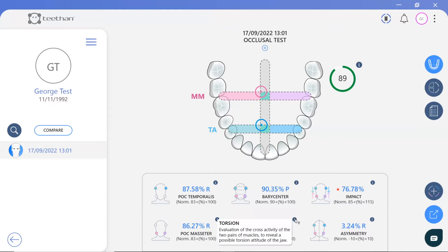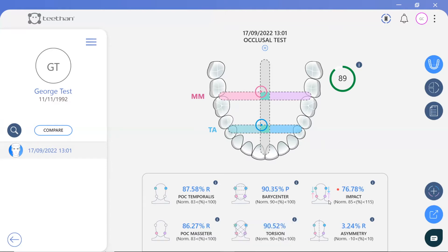Torsion evaluates the cross-activity of the two pairs of muscles to identify whether there is a possible torsion attitude of the jaw, which is not the case for this patient. If torsion is present, an arrow appears within the symbols in the direction of torsion.